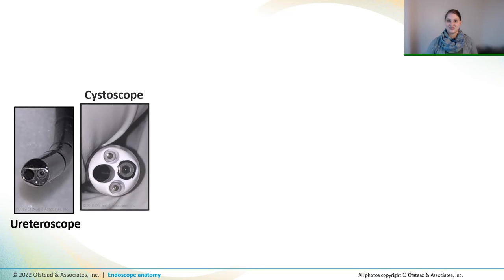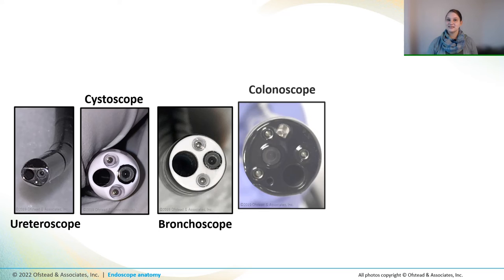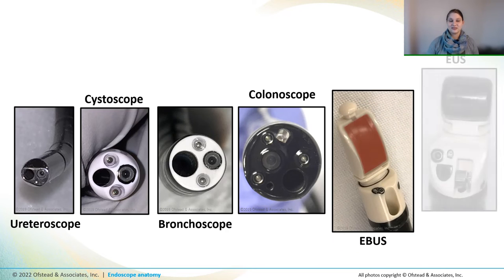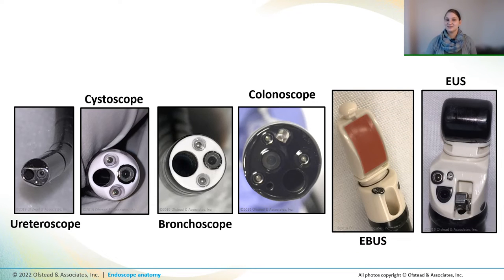Now let's take a peek at some distal ends. The complexity of distal ends reflects the complexity of the scope. And ureteroscopes, cystoscopes, and bronchoscopes have fewer components, while colonoscopes and other GI scopes tend to be more complicated. Some scopes look a little bit different. EBUS and EUS scopes have ultrasound tips on the ends. And some scopes, like EUS and ERCP scopes, have elevator channels. Each scope type and model is different, but they have a lot of the same components.